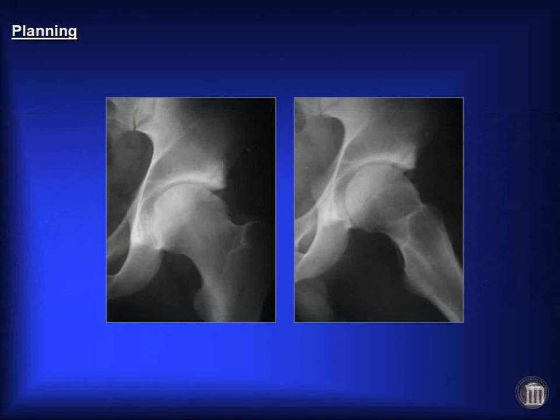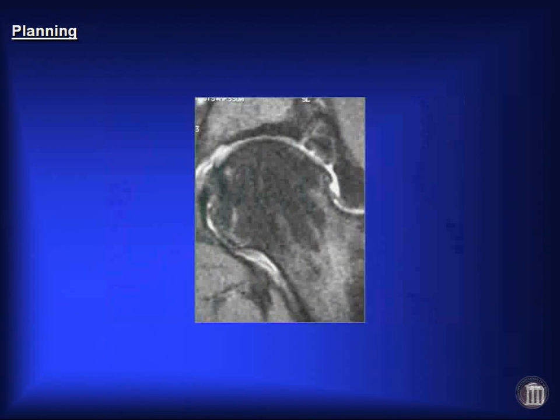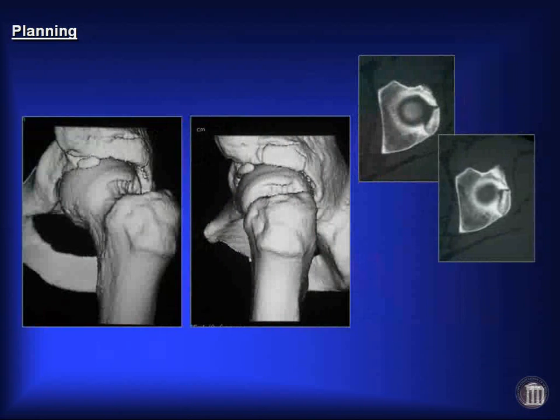Another illustrative example is a Marine who's got an obvious separate fragment off the lateral acetabulum. MRI partly reflects this, but on his CT scan, he's got a complex lesion with an os acetabulum anteriorly, pincer impingement, cam impingement, as well as a separate posterolateral bone fragment from the acetabulum.